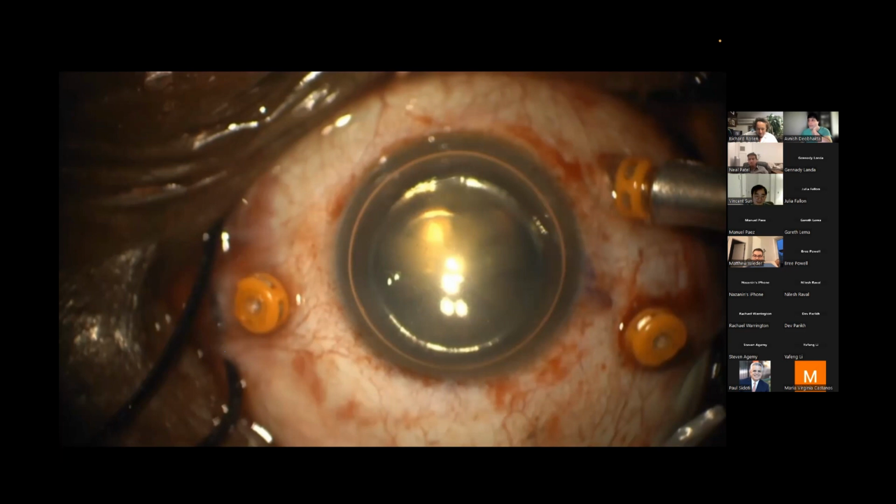I mean, the thing is, Dr. Landa, I know you do lens removal in TRD cases, but I don't think many of us would in this case. This is like running to the goal line and stopping to tie your shoe for no particular reason, and not scoring. You're very close to finishing this case. And if you didn't make a plan to do the cataract in the first place, I don't see why this would be the moment to do it.